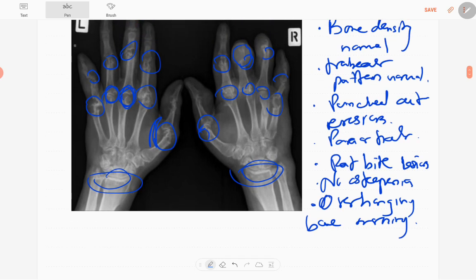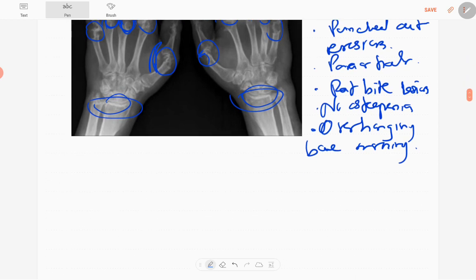There are erosions of the periarticular regions of the joints, prominently affecting the metacarpophalangeal joints, with a soft tissue component present. However, until the latter stages, joint space is preserved, and there is no evidence of osteopenia or osteoporosis. In this case, the diagnosis is gout.